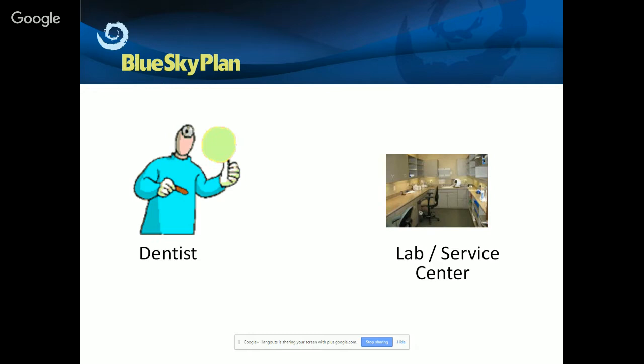There are dentists that are designing their own surgical guides, and there are dentists that prefer to have the surgical guides designed by a lab or by a service center. There's definitely a need for both.